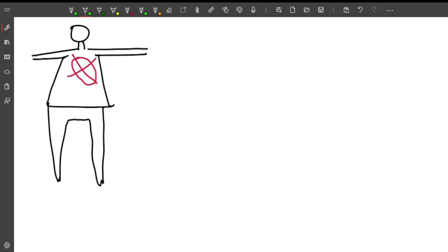So let me make this hands, and so there are 6 limb leads and 6 chest leads. Okay, so you will make lead 1, that is here positive, here negative. In between that you have lead 1.